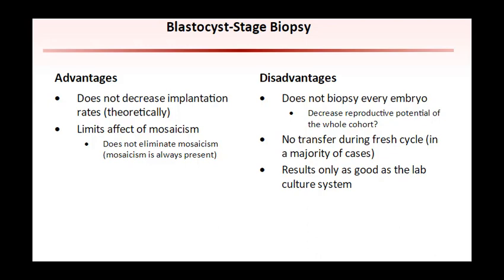If the biopsy occurs on day 6, for a majority of IVF labs, it is not possible to transfer embryos the same day, as it typically takes 24 to 48 hours to get results. This means that embryos must be cryopreserved, and the patient will subsequently undergo a cycle using frozen blastocysts. This may increase the cost of a cycle to the patient.